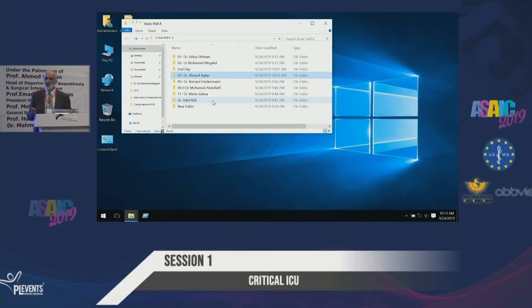No. The trigger window, this is if you want to shift, to wean the patient from SIMV, what you do is decrease the mandatory, see how frequent the respiratory rate of the pressure support will be, and after that shift from the SIMV to the pressure support to take you away for weaning.